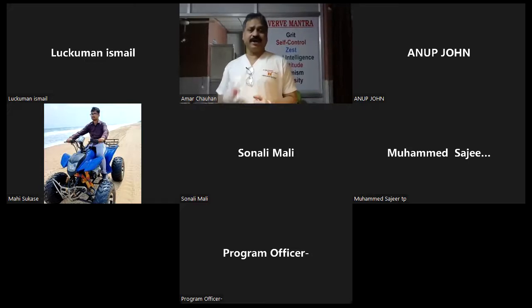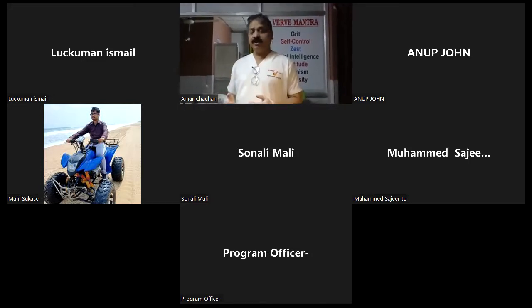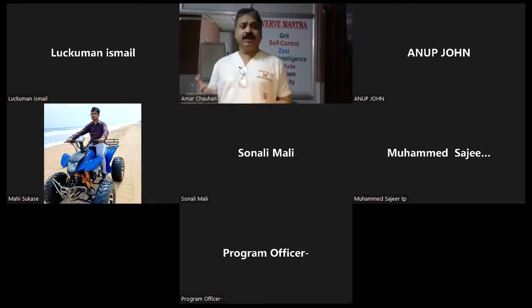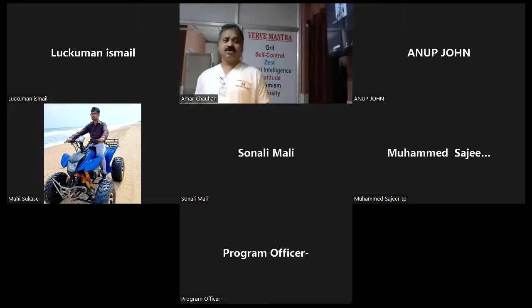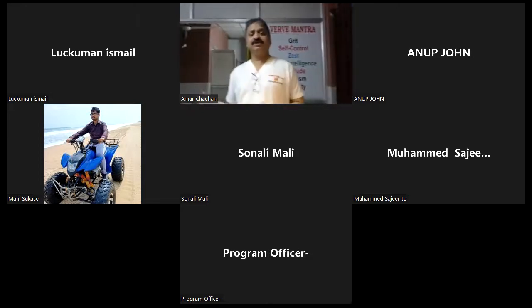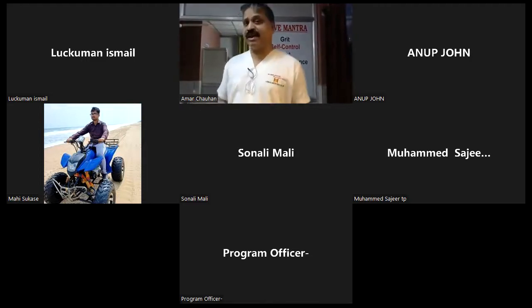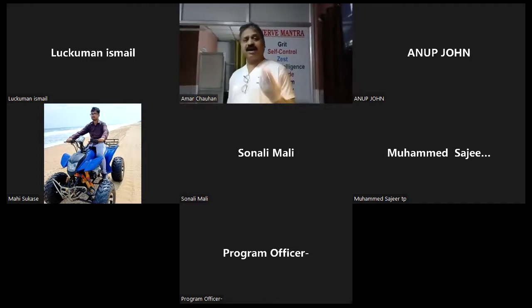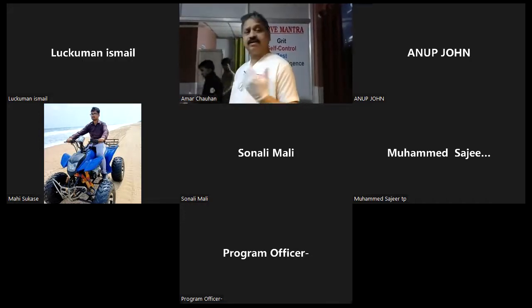You don't have to pump the air. In the surgical cricothyroidotomy, you get air when you puncture the membrane. And in ICD, you feel inflation and deflation of the lung and the bubbling in the underwater drainage. These are additional features which no other mannequins have. Since I am a practicing ER physician and STEM educator, I have incorporated these special features because when I was learning, I had difficulty in learning these things.